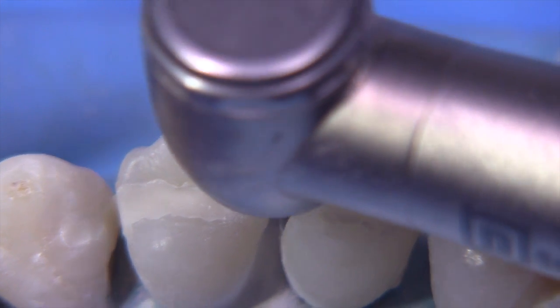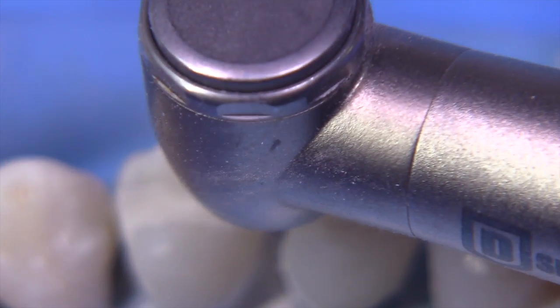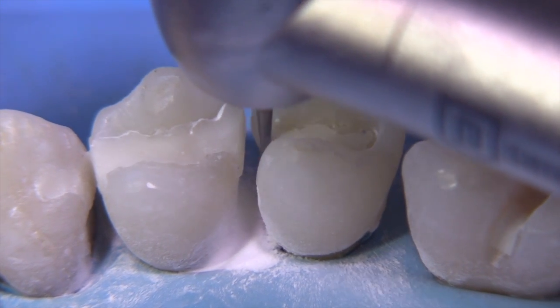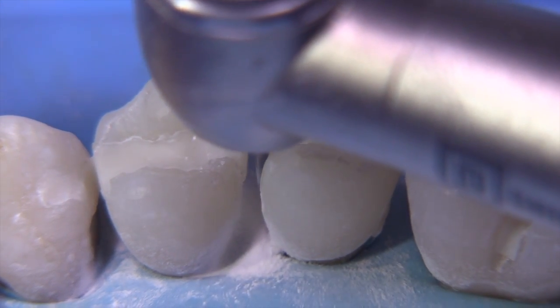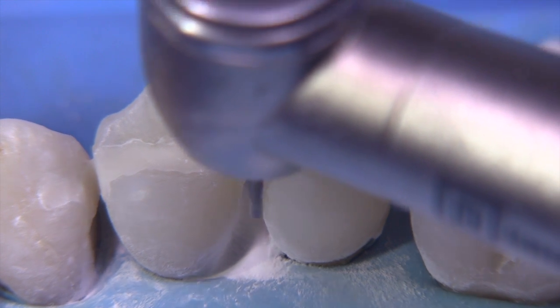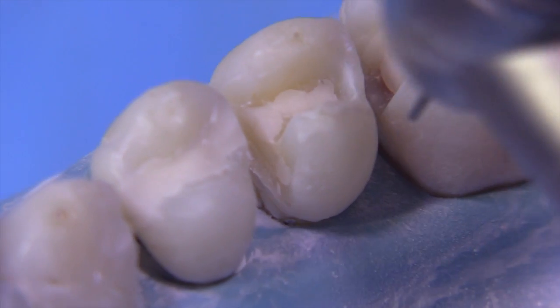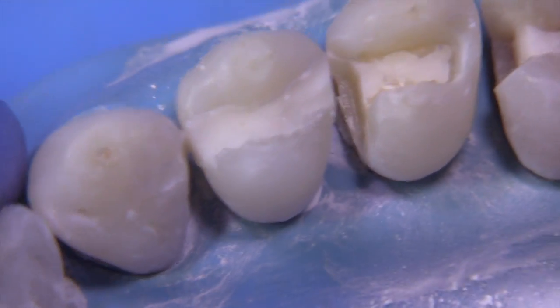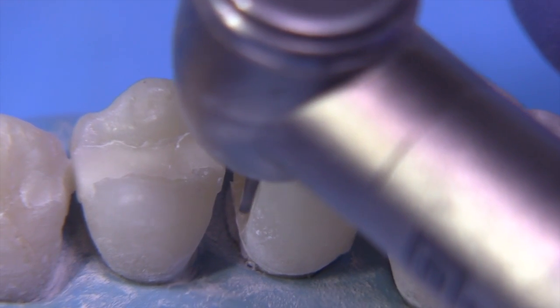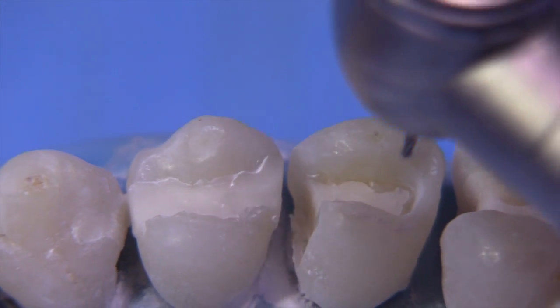We probably want to go about 1.2 to maybe 1.4 millimeters deep at the gingival — in other words, the axial depth at the gingival — because we are going to be placing some retention features in the gingival wall of this preparation. The problem is we still have that lingual undermined area. When you encounter blockout that remains on the lingual wall because of an undermined area, you just keep extending the wall until you've moved past the blockout material. That necessarily is going to cause this wall to flare significantly. So when you do this, you lose a lot of resistance form, because you no longer have that lingual wall to keep this from rotating. That leaves us with a resistance form challenge, and we're going to have to come up with a method to overcome that challenge.